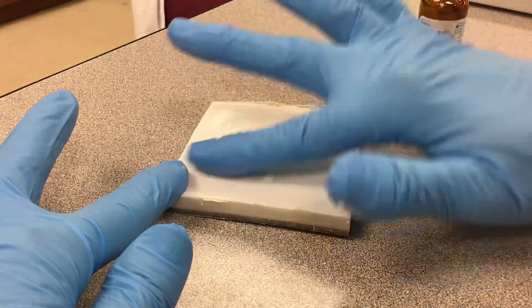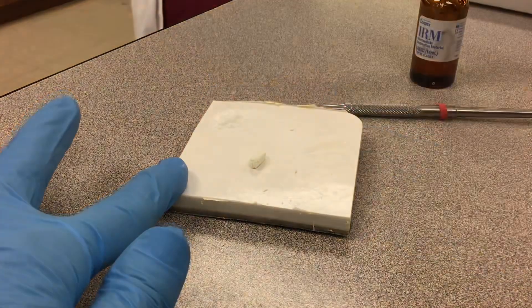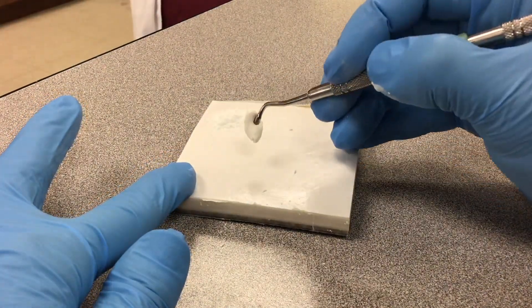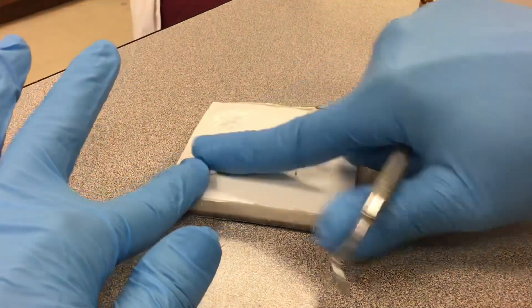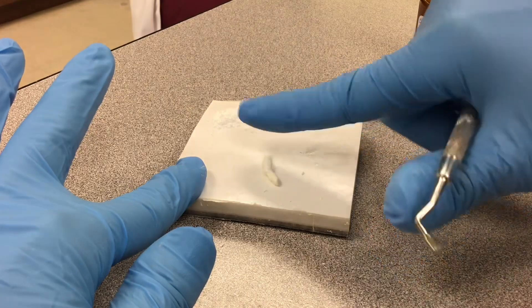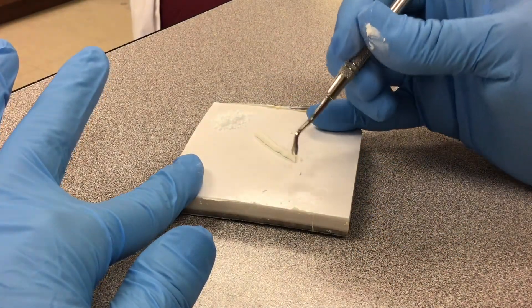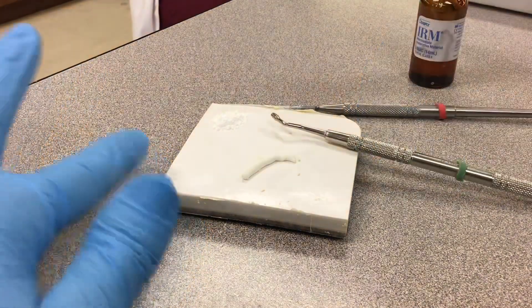Then I can actually do two things. If it's a huge filling, I can get my condenser, put it on my condenser and put it in the filling. Or, what we're doing — a base. What you do is roll it up to a little tiny ball, get a little bit off, and then go ahead and put in your base. This is CoE — the base of CoE.